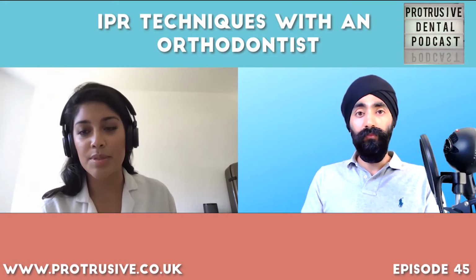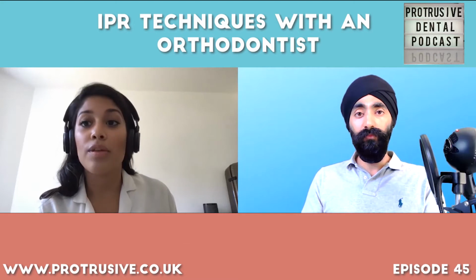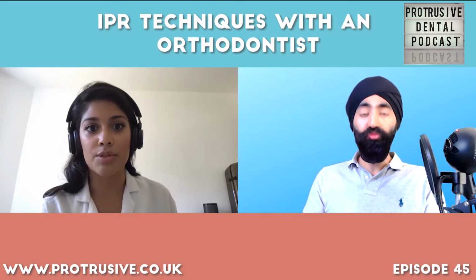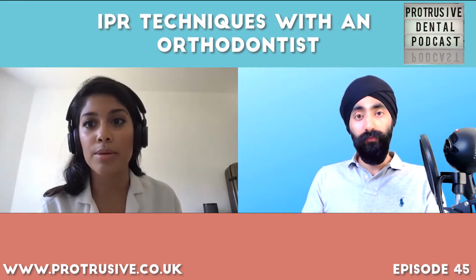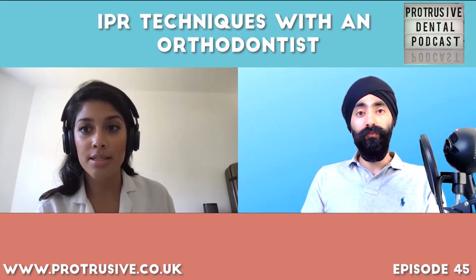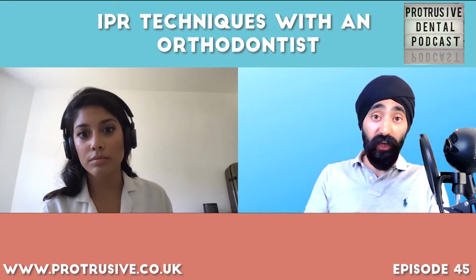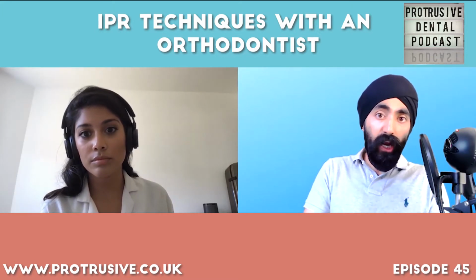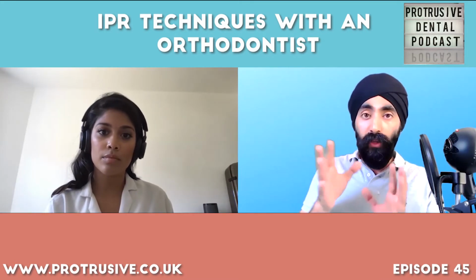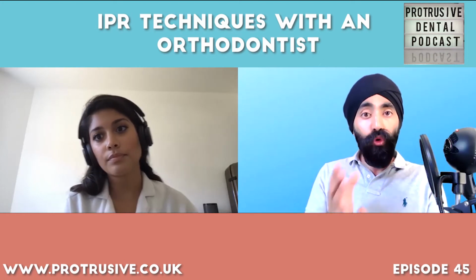It's an acceptable amount. And then there have been studies to show that removing more than 50% of the enamel thickness can be detrimental to the tooth in terms of developing decay and periodontal problems. So that's why anything less than 0.5 millimeters is deemed acceptable. So the take home message is if you're in and around 0.5 or less, you should be okay as a whole. Obviously, there are other tooth morphology issues we'll come on to later. But as a general rule of thumb, 0.5 and below is fine.